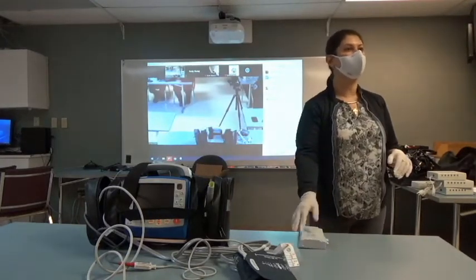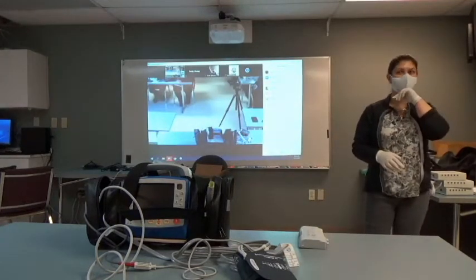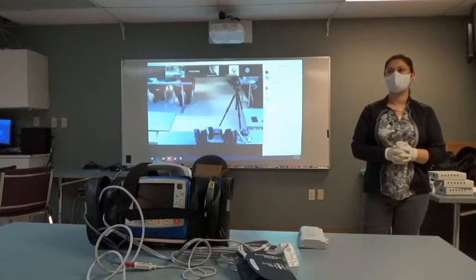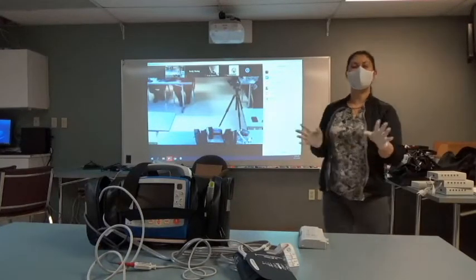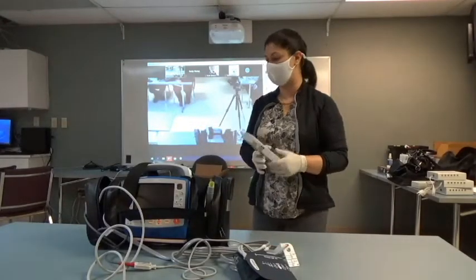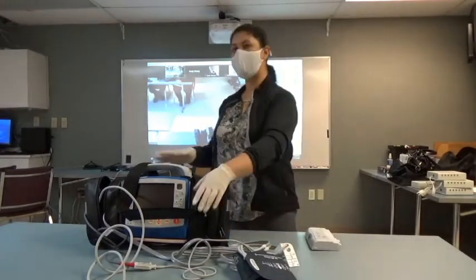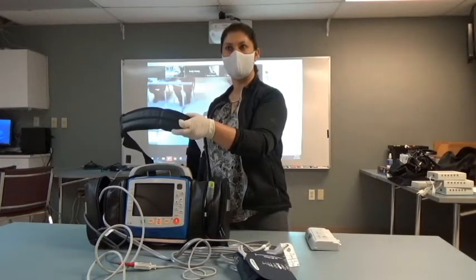We don't want to leave it for months and months on end without ever visiting a base charger. So that's something you guys can discuss later and figure out a rotational schedule for. Okay, any questions about the back of the device or your battery?